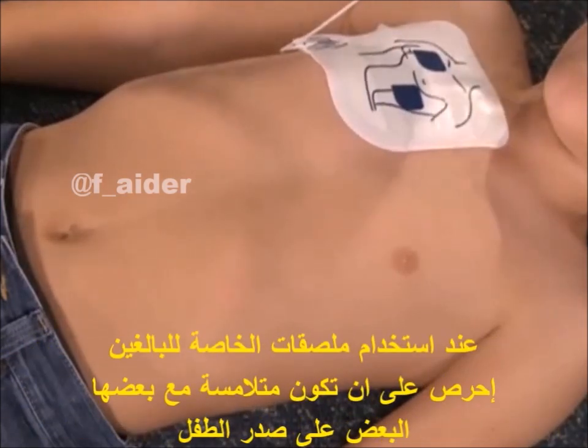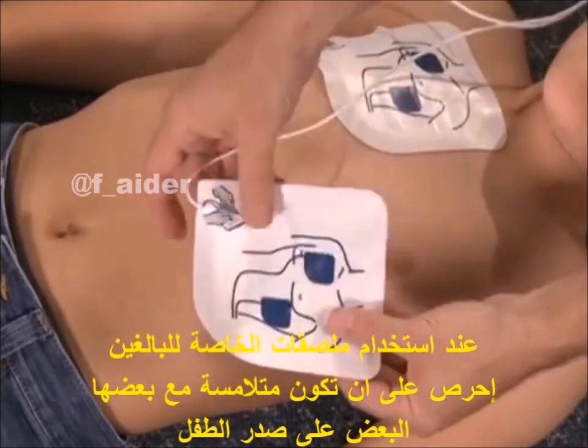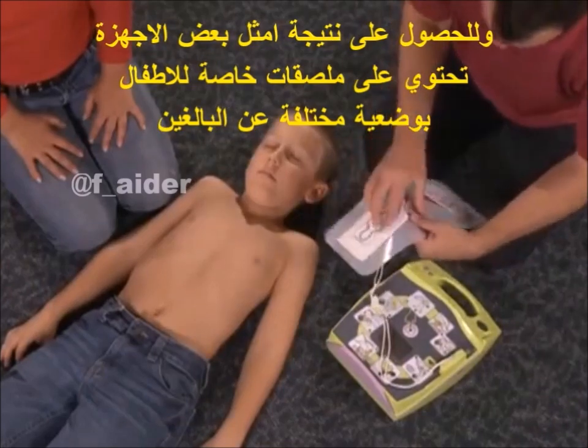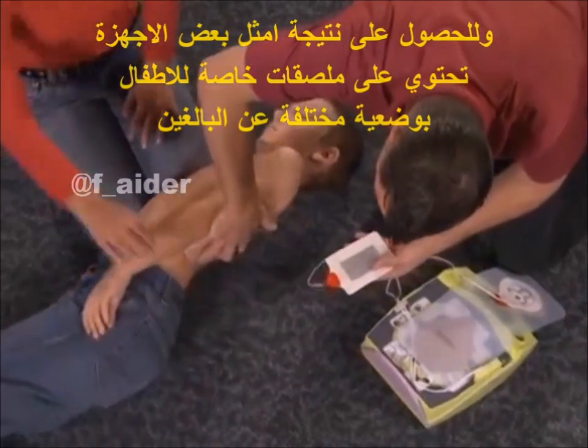When using adult pads on a child, ensure that the pads do not touch each other on the child's chest. For best shock results, some manufacturers illustrate placement of child-specific pads differently than adults.